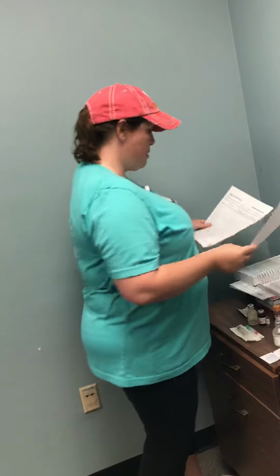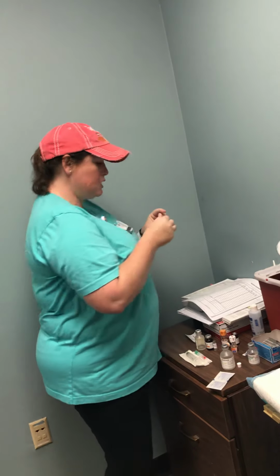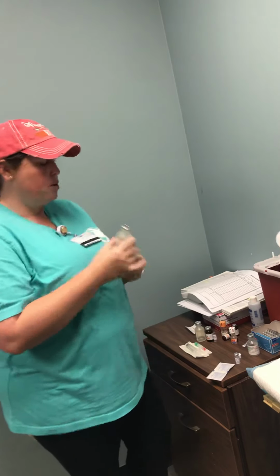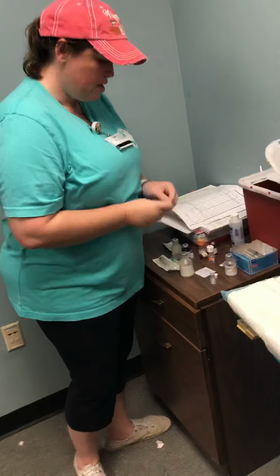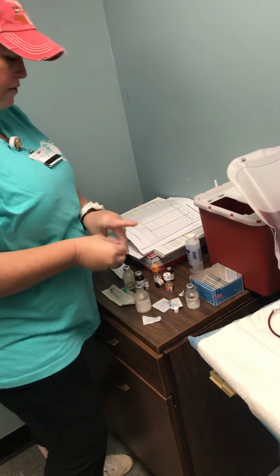So now I'm going to go to the med room and prepare my medicine for my patient. I'm going to wash my hands. I'm going to check my medication against my MAR. It's morphine. And the expiration date, it is not expired, so we're good. And then what we're going to dilute it with is normal saline. So I'm going to prepare this medicine. I'm going to draw up my morphine first.